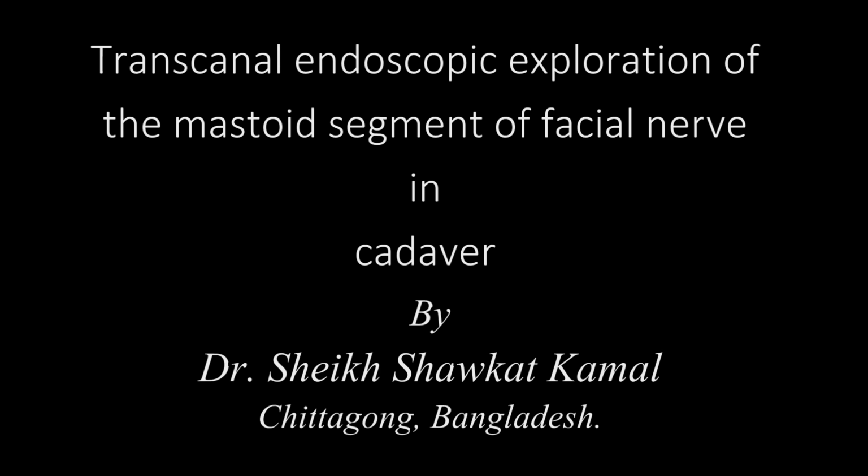Dear viewers, the transcanal endoscopic approach to the facial nerve is a growing issue in endoscopic ear surgery. For instance, in recently developed endoscopic lateral skull-base surgery, tympanic and mastoid segments of facial nerve need to be manipulated in order to create a wide passage to the internal auditory canal. To address such an issue, this video will discuss two possible transcanal endoscopic approaches to the mastoid segment of facial nerve on cadaveric temporal bone.